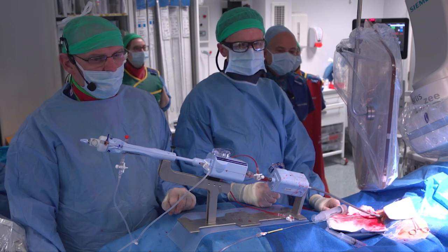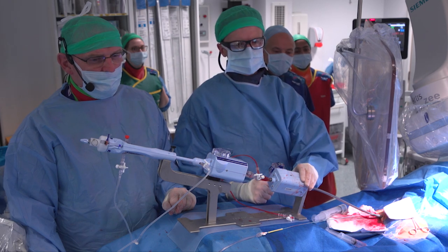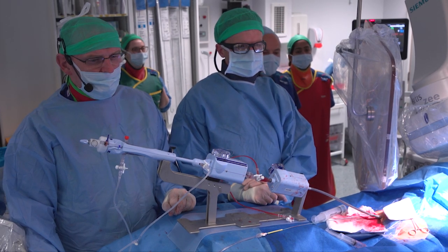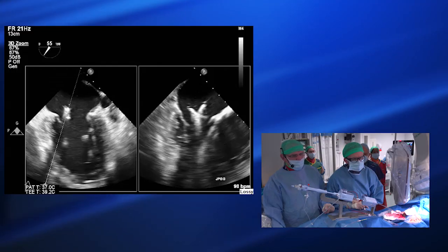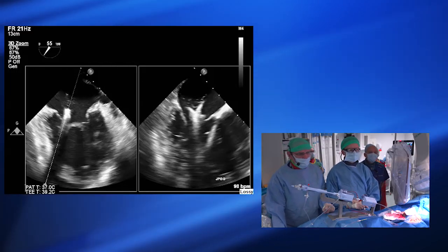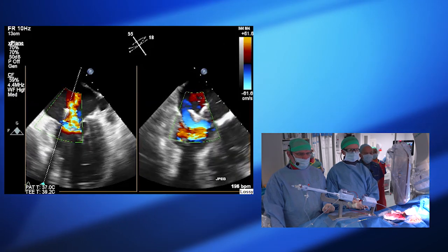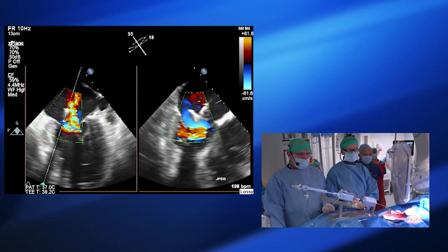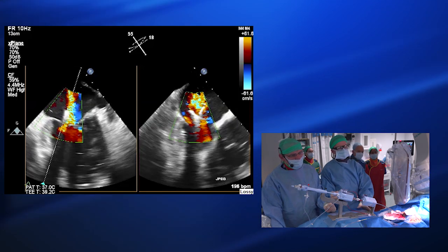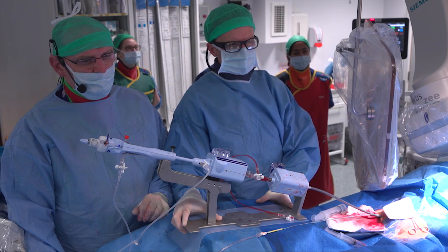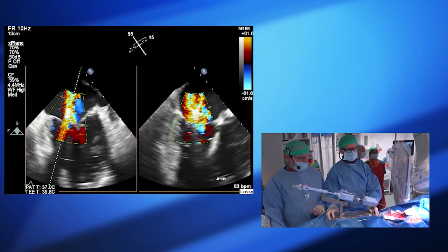We're now happy with the clip orientation. It's the first clip so you can easily cross the valve open — you don't need to close to cross the valve. We're going to put colour on and see whether we're splitting the jet, and we want to be probably just on the medial side of the jet. To me that's probably a bit too medial — most of the jet is coming on the side of the clip and I don't want to leave a big medial jet. To move more lateral, I'm going to advance the whole clip.